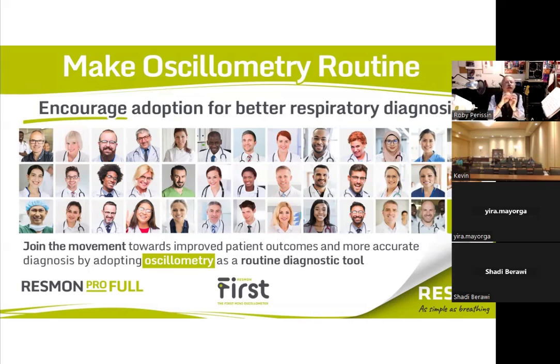One little hurdle is that for the moment, and we are working possibly to have that change in the future, you cannot reimburse on the same day forced spirometry and respiratory oscillometry. So we have to find ways to do it. But in any case, the good news is that if you ever wanted to add the oscillometry test, and therefore add the advantages of oscillometry, it's less than 5 minutes. Remember the rule of the 5 minutes: no matter how sick the patient is, how old the patient is, how young the child is, the complete oscillometry routine will take less than 5 minutes.